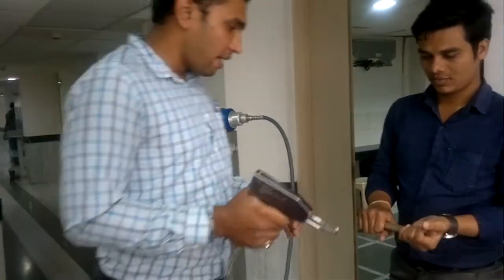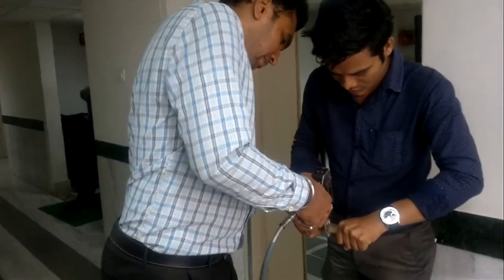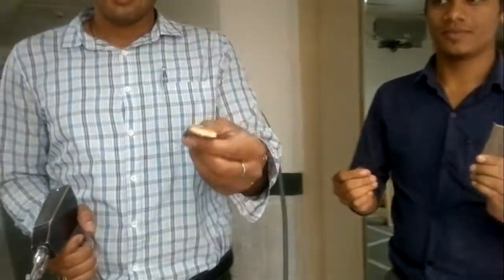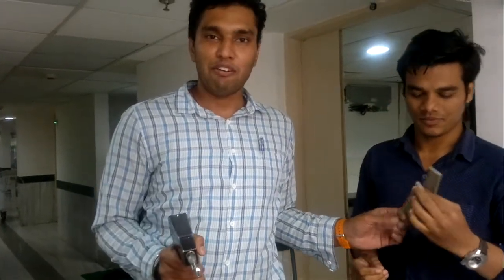We can also have a demo. You can see the power. The wood is now in two pieces. So this is the power of the sternum cutter and this is how it is used.